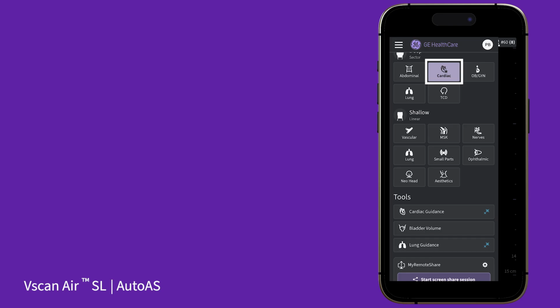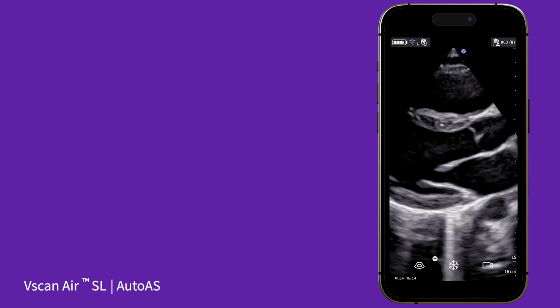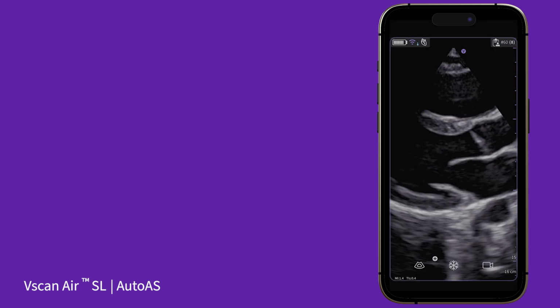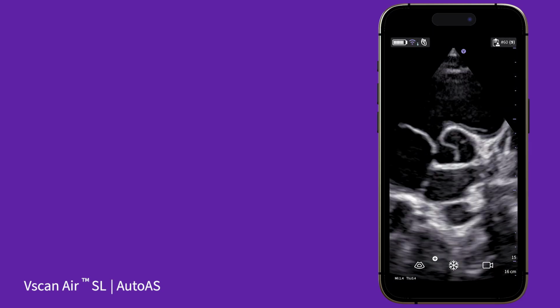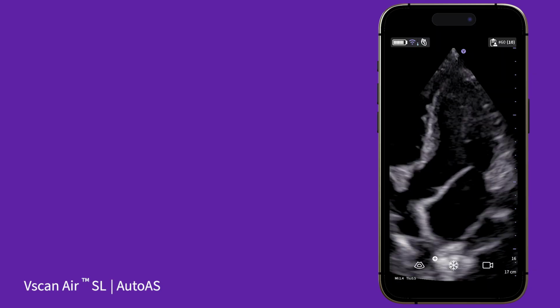Activate the cardiac preset. Optimize the image for a parasternal long axis view and tap the Store Video icon. Do the same for a parasternal short axis view at the aortic valve and for an apical 5-chamber view.